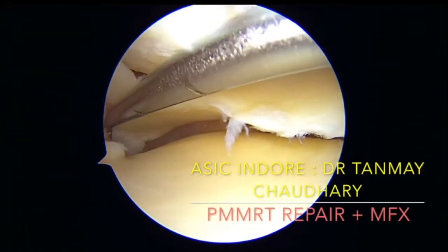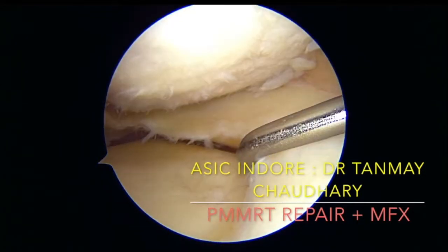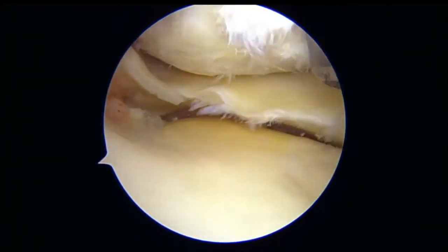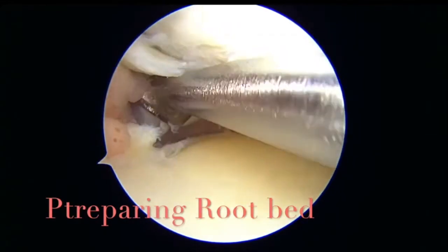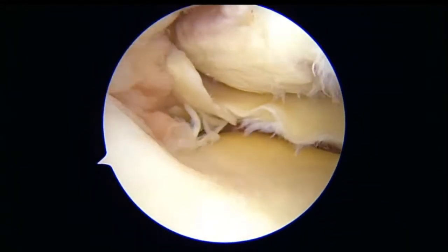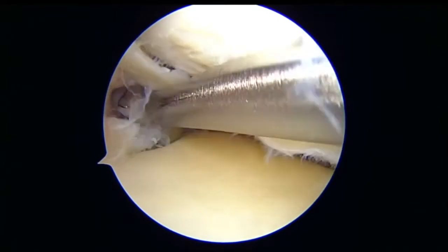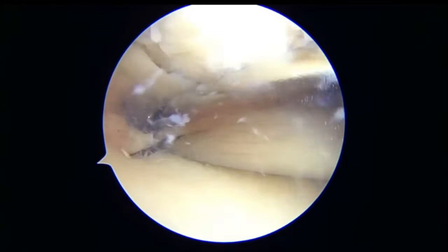As you can see in the video, there is avulsion of the posterior root of the medial meniscus with degeneration in the medial femoral condyle. So we go ahead for doing a posterior medial meniscus root repair. We first prepare the bed with a ring curette to take off the cartilage and have a bare bone for good bleeding.